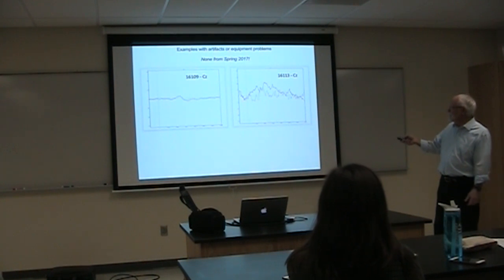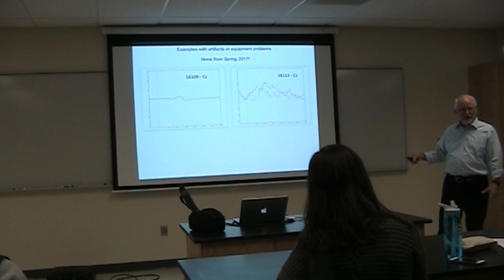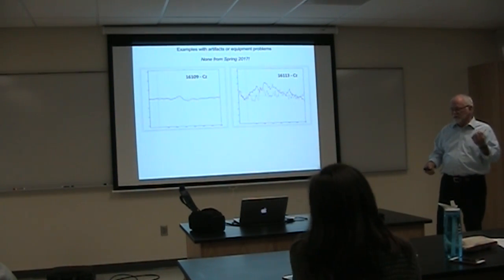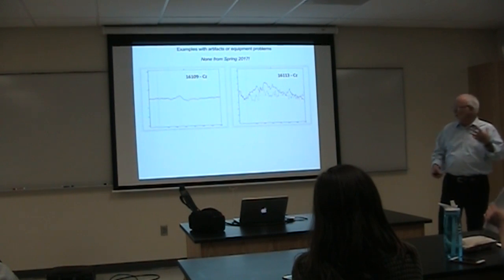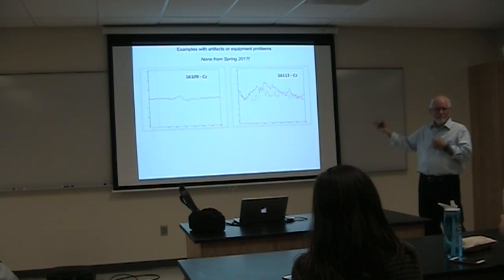And this is not participant error. This is electrical interference. Something was going wrong. And it could happen, the experimenters were pretty good at noticing if you were wearing jewelry or anything else. But let's say you had massive work done in your teeth or whatever. You had a lot of metal in your head some way.